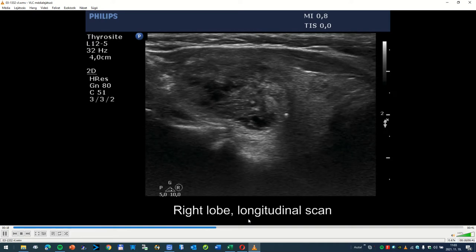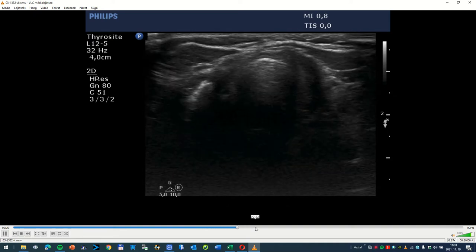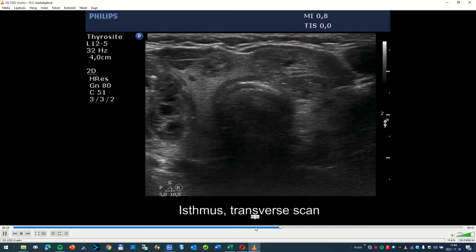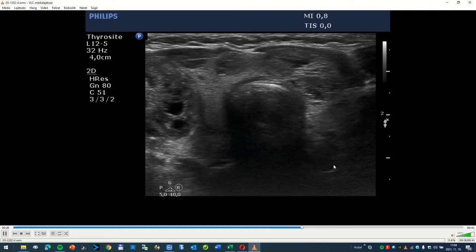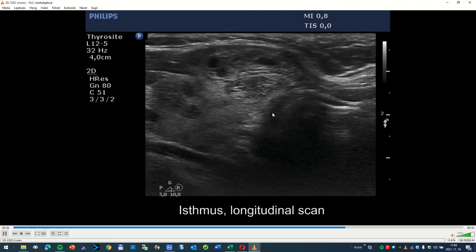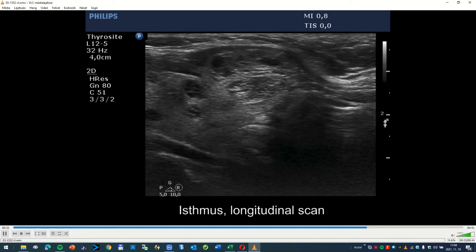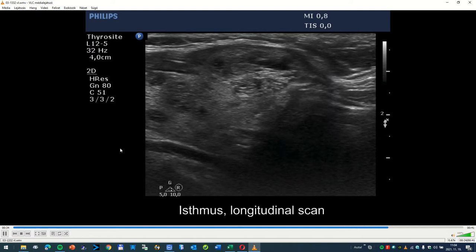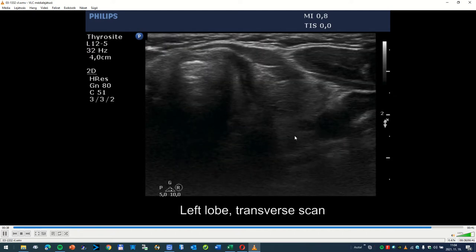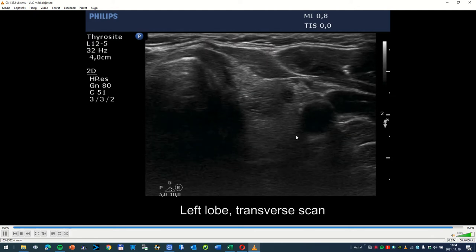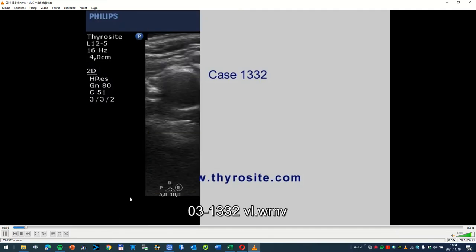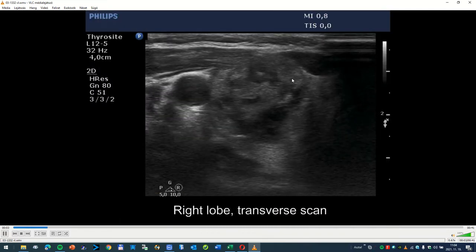If we go further with this video, we can see that this patient had several other partially cystic nodules. Considering the entire presentation of the thyroid, it is a fact which should calm us down regarding the larger lesion. It is a reasonable assumption that this patient had six to ten discrete partially cystic lesions, and this was only the largest one presented here.